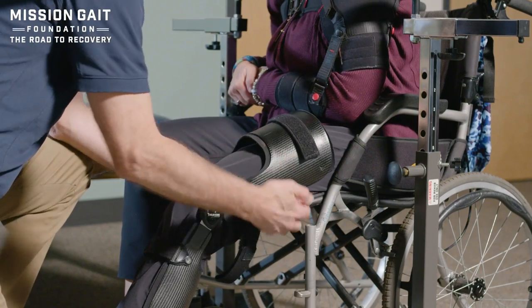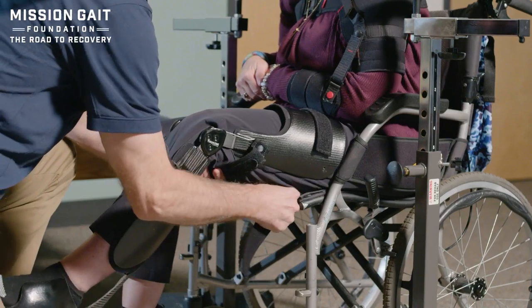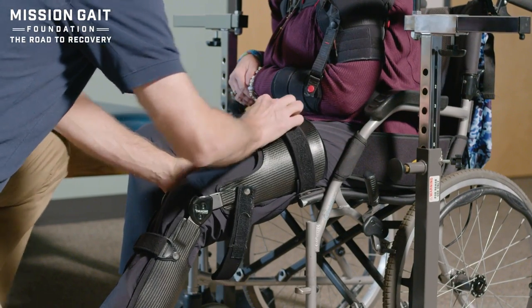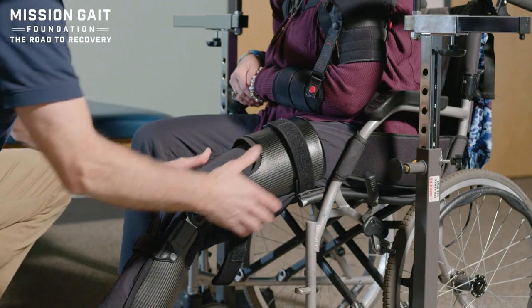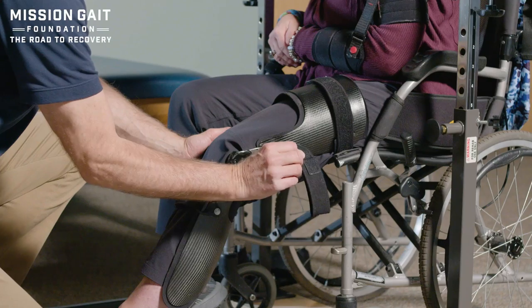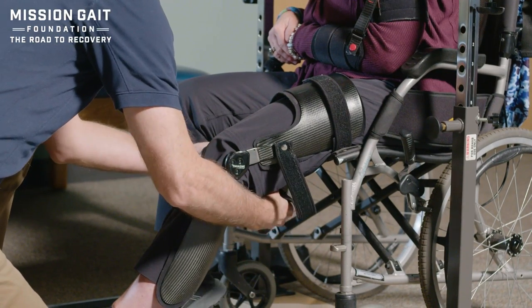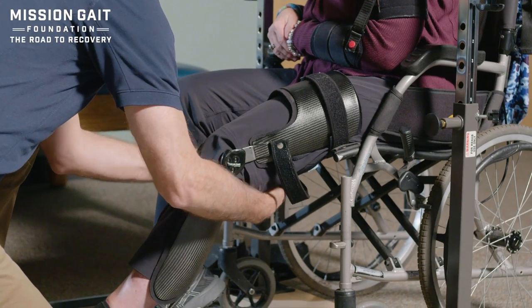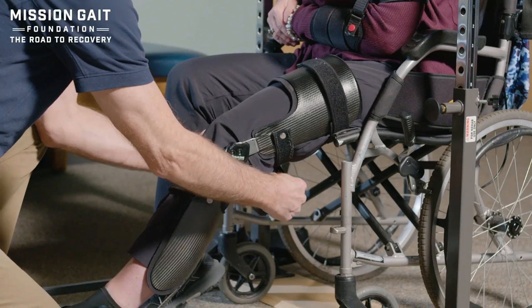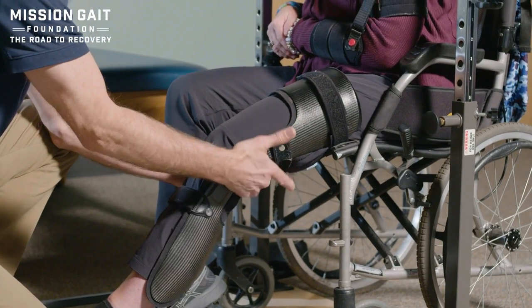The top strap is the one that holds the brace in alignment, but doesn't want to be too tight. I'm going to lift up a little bit, come underneath her leg, and take up all the slack, but in no way trying to cut off the circulation. The last strap, as we talked about, is the money strap. This strap is going to keep her from going into hyperextension. In this particular case, I'm going to bring this around and loop it through, then pull her leg forward in the brace so I can take up all the slack on this posterior strap.